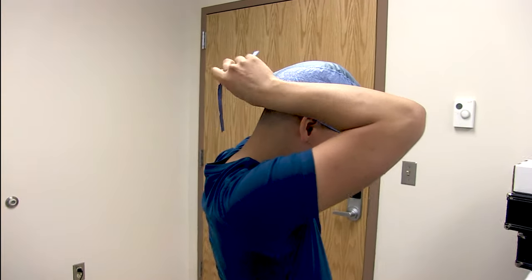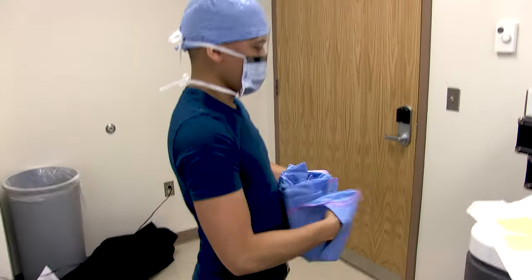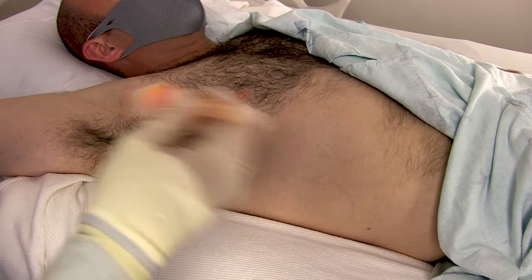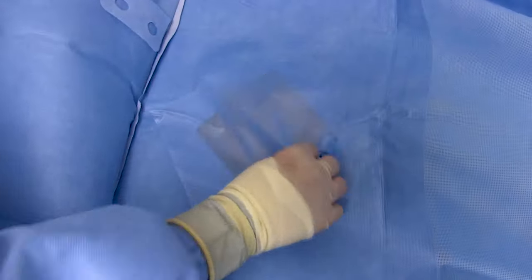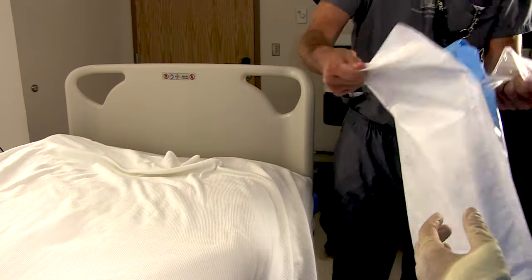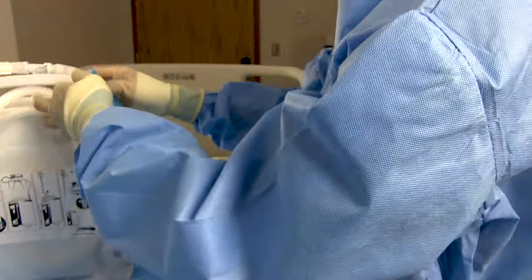With preparation out of the way, it's time to gown and glove up. Once sterile, go ahead and start prepping and draping the field, keeping in mind where your landmark is going to be so you can access it. For demonstration purposes I'm putting the thyroid drape on here upside down on purpose to show you that if you don't have a lot of drape at the foot of the bed, you can use the water seal suction canister's sterile sheeting to give yourself some extra sterile field there.